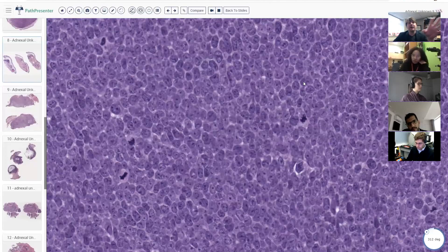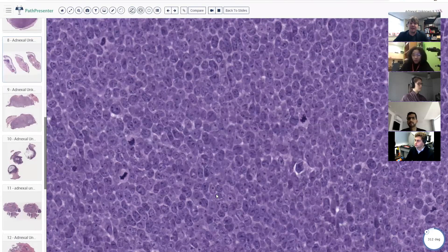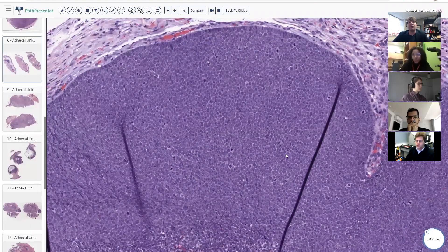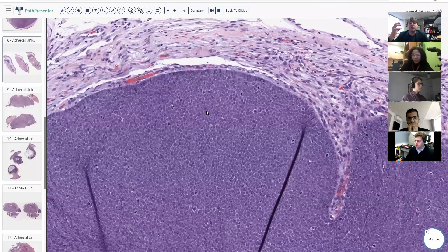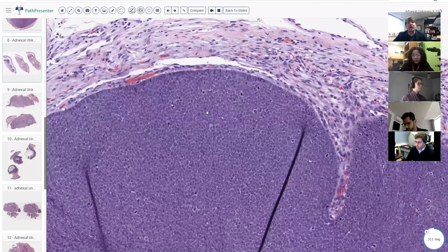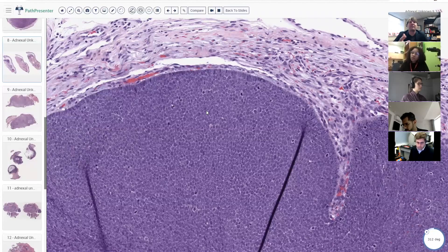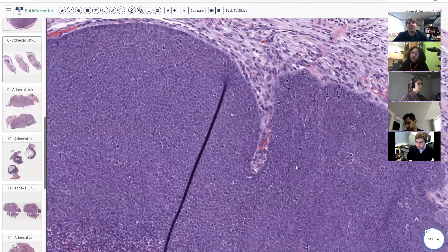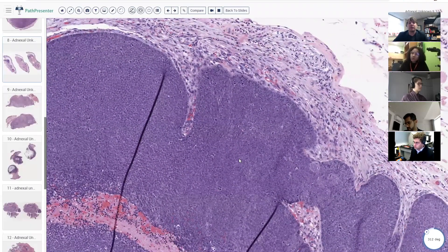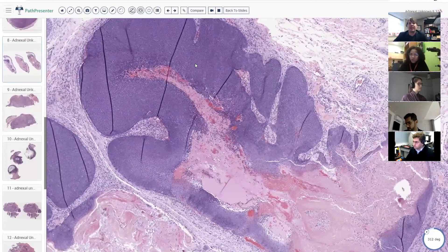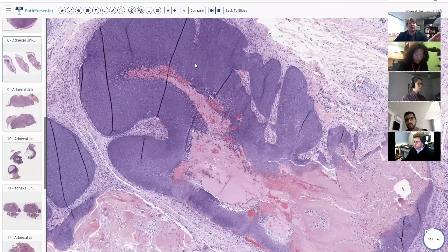Context is everything. On cytology, I can imagine someone puts a needle into this area and goes down the tubes real fast. In context, we know this is totally fine. Mitotic activity is usually present in the basaloid cells and is usually florid — tons and tons of it. I get cases regularly where people send me slides really worried about too much mitotic activity, and the answer is always no, it's okay. Atypical mitoses or wildly pleomorphic cells are more concerning for malignant pilomatricoma.